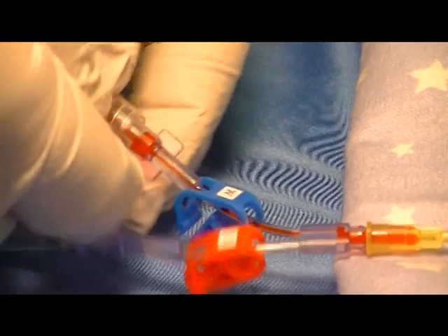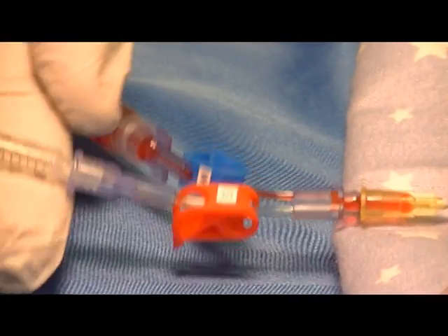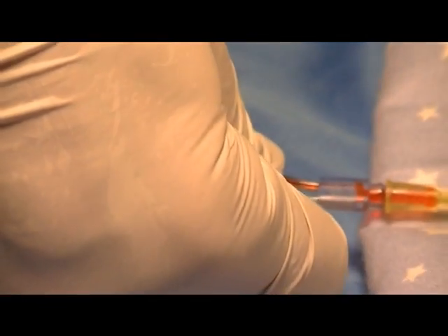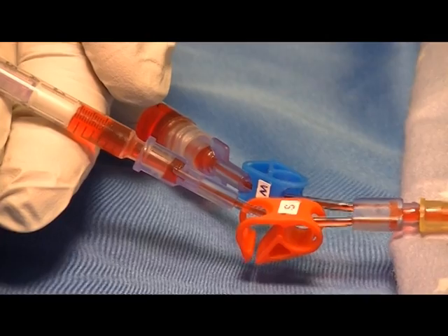Once you have drawn 0.5ml of waste, reclamp and go to the sample side, unclamp, and allow the sample to fill to the preset volume.